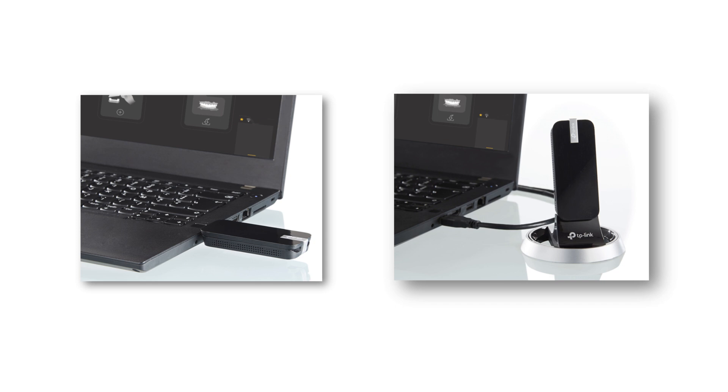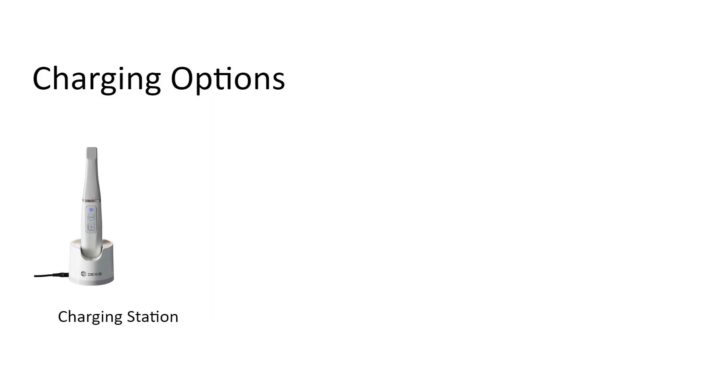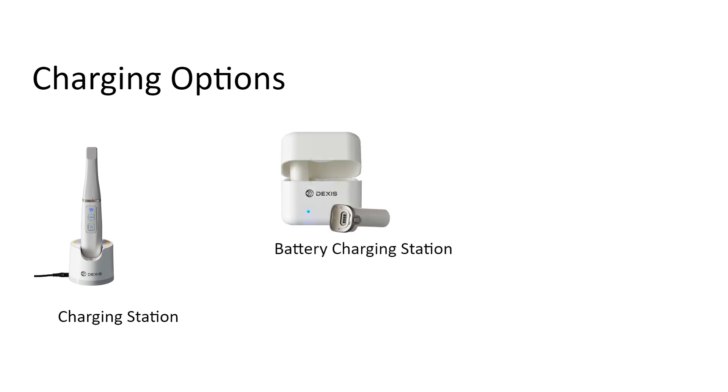The Wi-Fi adapter plugs into the USB 3.0 port on the computer running the ScanFlow software to increase speed and signal strength. The dock for the Wi-Fi adapter is used as an extension cable when you cannot easily plug the Wi-Fi adapter into the USB 3.0 port due to space limitations. Note: you must raise the antenna on the Wi-Fi adapter for reception. The rechargeable battery can be charged in the handpiece in the charging station, or the battery can be removed and charged in a battery charging station, an optional accessory. The backup power cable can be used instead of the battery to power the scanner.